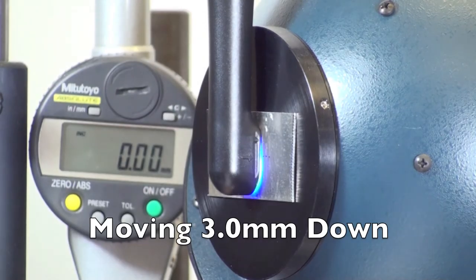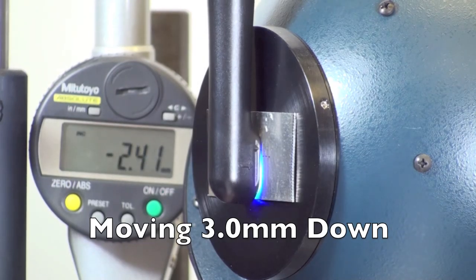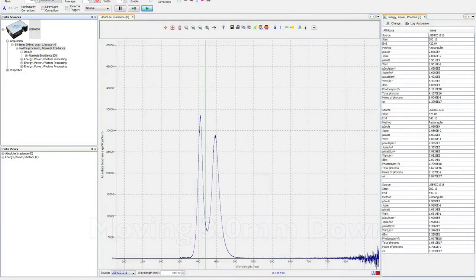We're now going to show what happens when you move the curing light down 3 mm. As you can see, as the light moves down, the ratios of the two peaks changes quite dramatically.